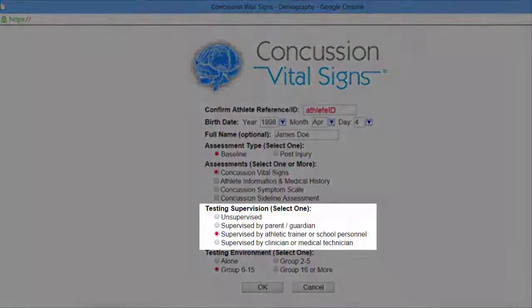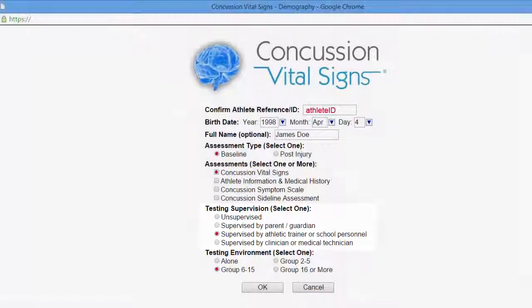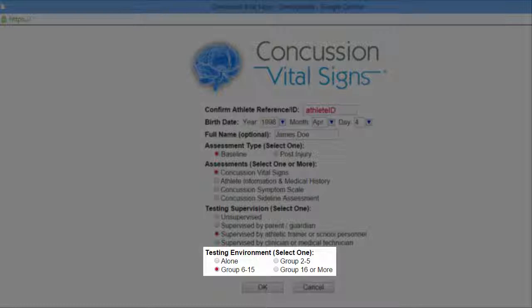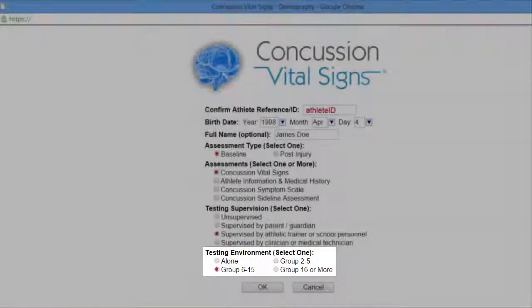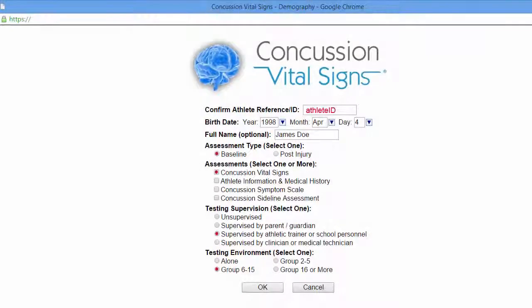Then under the Supervision Status, check what the situation is. In this case, we'll choose Athletic Trainer or School Personnel. In the testing environment, in terms of the size of the group, we'll choose a group size of 6 to 15. Click OK to confirm these settings.